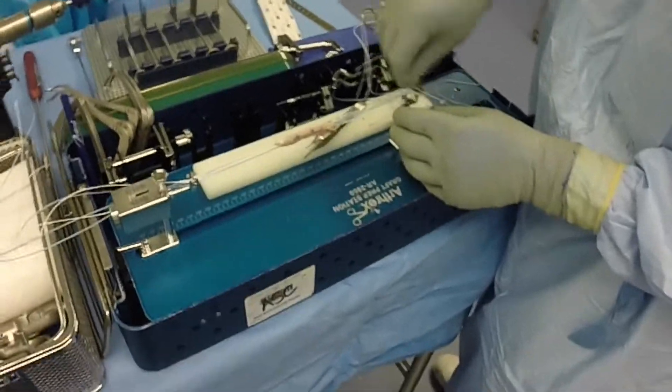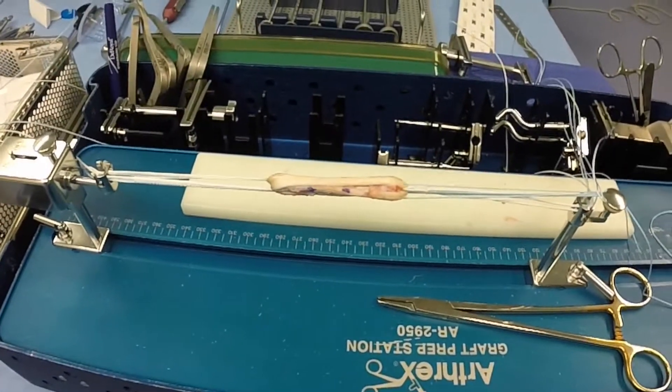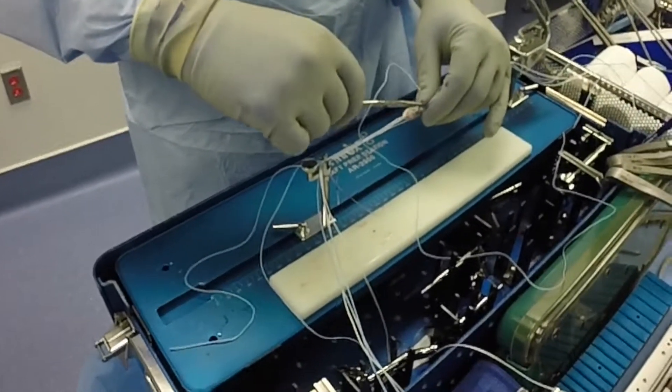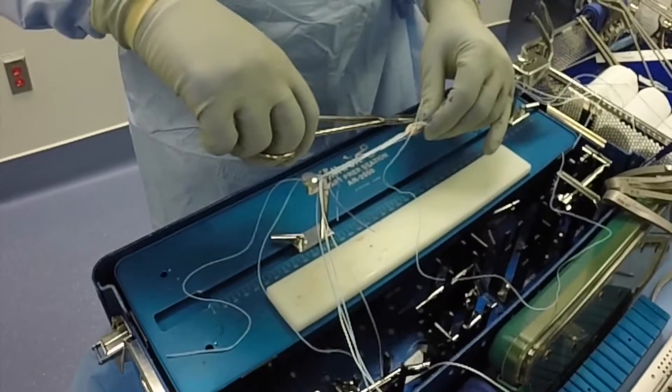The tapes are then secured to the graft station, and here you see the quadrupled graft prior to cerclage stitches being placed. We then placed two cerclage stitches.